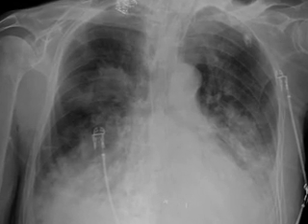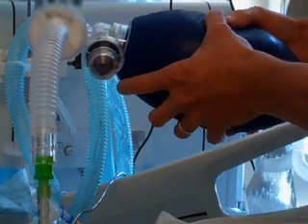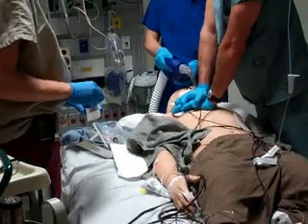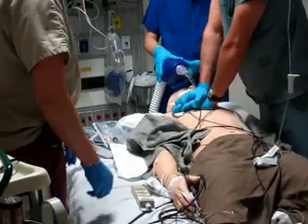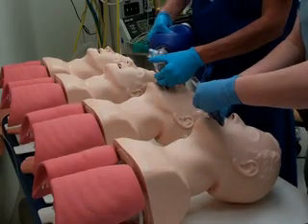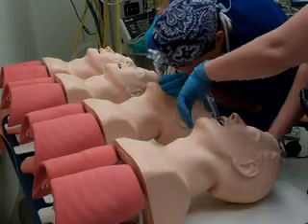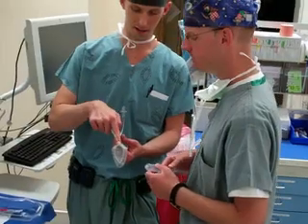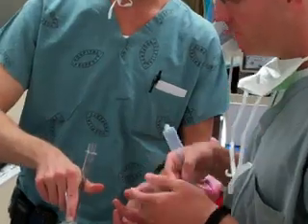It may also be difficult to ventilate a patient with laryngeal mask airway when high airway or thoracic pressures are encountered, for example during vigorous chest compressions, or in obese patients, or patients with parenchymal lung disease. Additional familiarity with the laryngeal mask airway can be gained with practice on a training head model, on a patient simulator, or on real patients in the operating room under the guidance of an anesthesiologist.